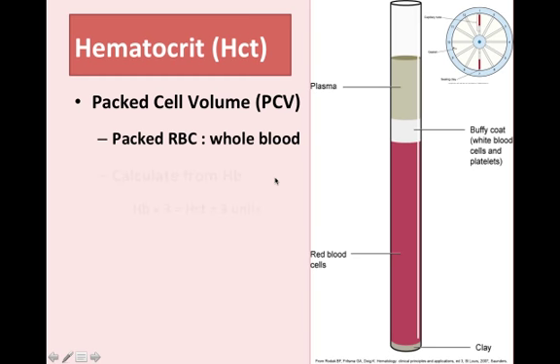From the hemoglobin measurements that we got prior, you can estimate what the hematocrit is and make sure that things are making sense. So if you take your hemoglobin measurement that you got using the Drabkin's reagent and spectrophotometry and multiply it by 3, that should report your hematocrit within plus or minus 3 units. And since this is a ratio, there are not actually units on a hematocrit. It's just a percentage, essentially.